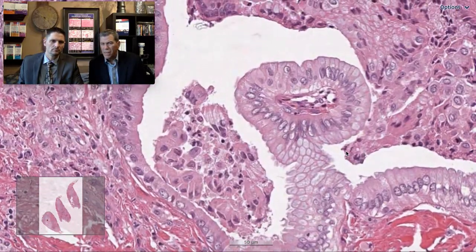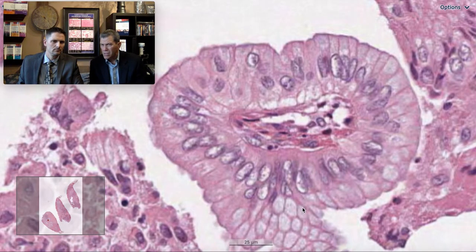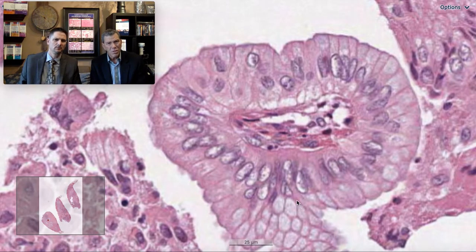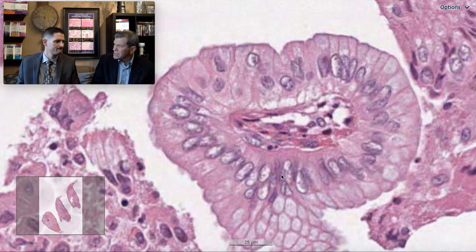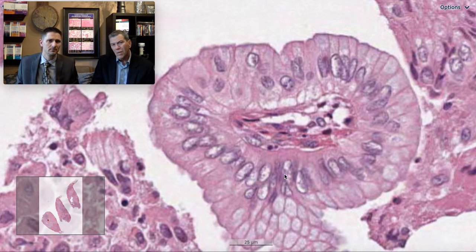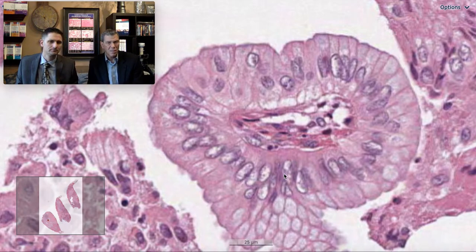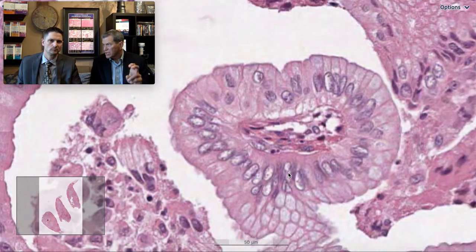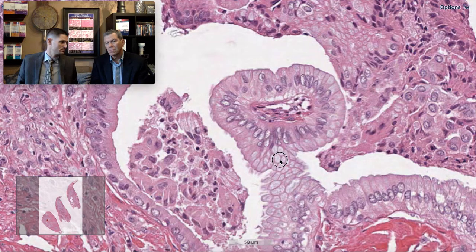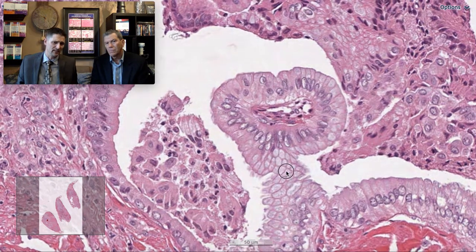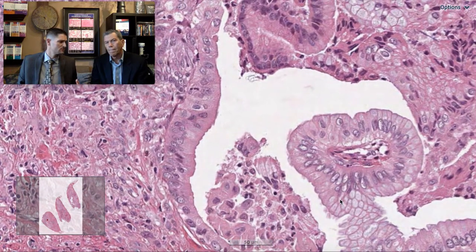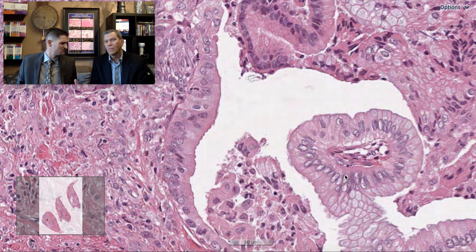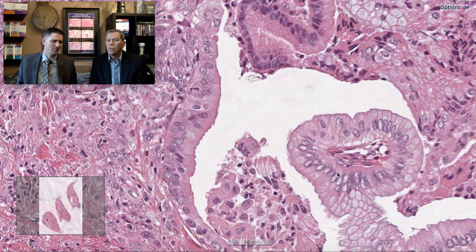Look at those pale cells — that's unusual. Ciliated epithelium in the lung generally doesn't have this pale appearance to the cytoplasm with mucin vacuoles. You can have goblet cell metaplasia, so if you have the possibility of normal or metaplastic mucinous cells, how are you going to diagnose mucinous adenocarcinoma? There are stains we can do, but architecturally this looks like a papilla — it's got a central core and probably a vascular structure. Peribronchiolar metaplasia shouldn't be forming papillary projections into luminal spaces.